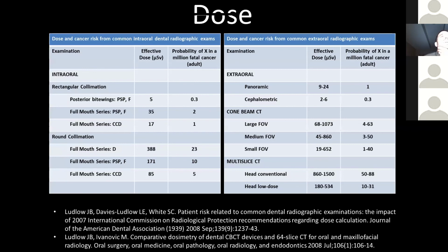Is it appropriate to take CT images at a comprehensive exam on new patients? Probably not at this point in time from a dose and diagnostic perspective. And again, if you review the ADA radiographic image selection criteria, it doesn't discuss cone beam CT at length all that much, but it'll discuss new patient imaging, and their recommendation at this time is if it's a simple patient, a pan and bite wings, and selected periapicals based on teeth that might have, like, tooth of the crown, you might order a periapical just to evaluate the periapical bone.